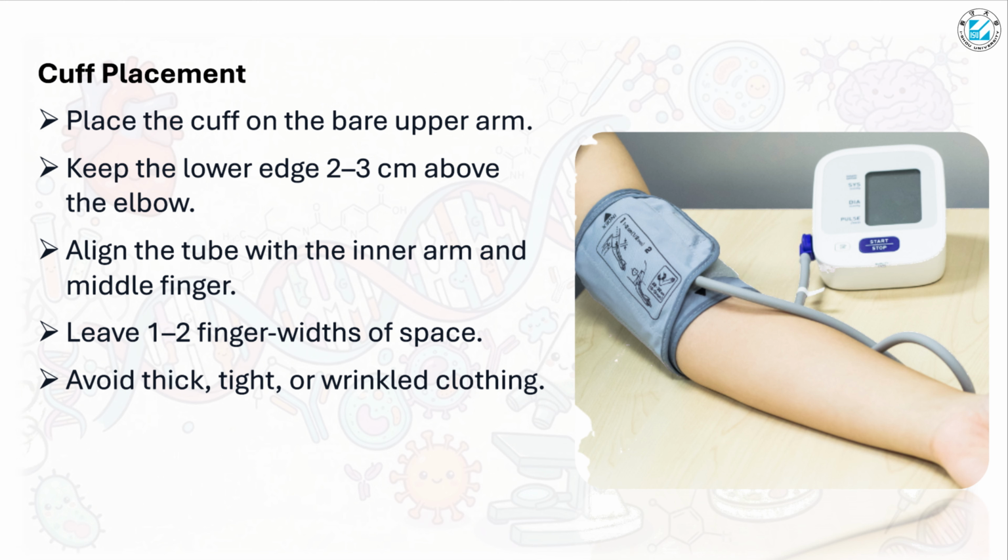Leave about 1 to 2 finger widths of space between the cuff and the arm. The cuff should not be too tight or too loose. The cuff should be in direct contact with the skin. If it is placed over thin clothing, make sure the clothing is not too tight or wrinkled.